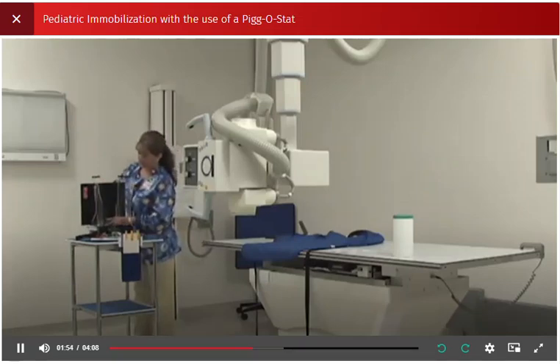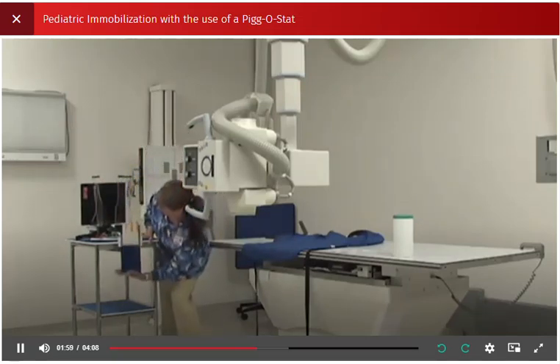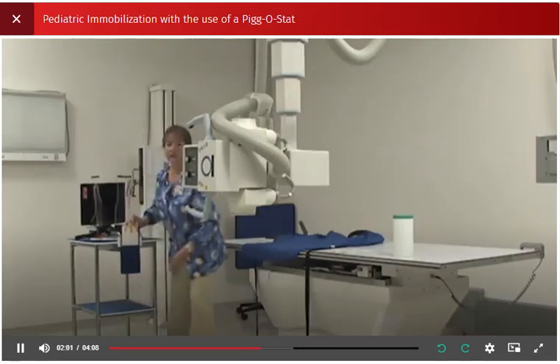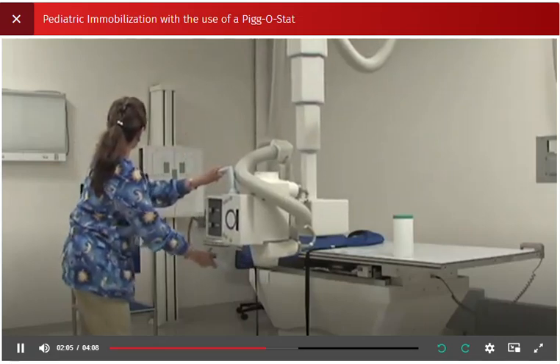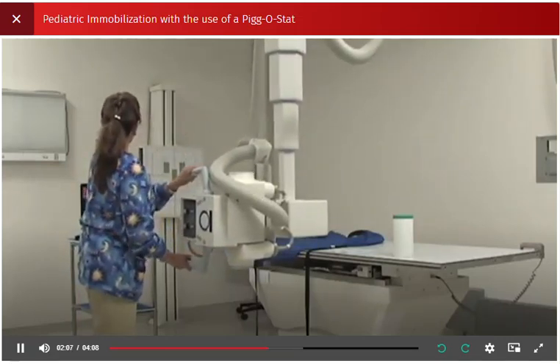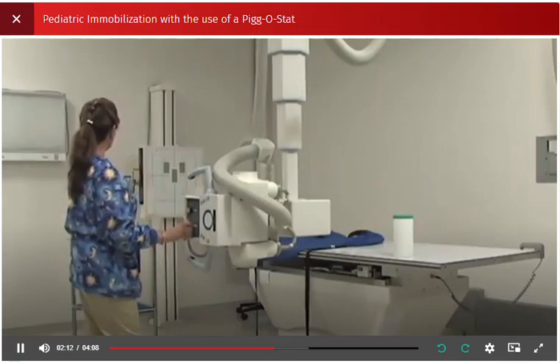Place the correct lead marker on the correct side of the patient and collimate for radiation protection and image quality. Place the gonadal shielding next to the Piggostat or use the shielding located on the Piggostat. Go to the console and select the appropriate technical factors for a pediatric chest X-ray.